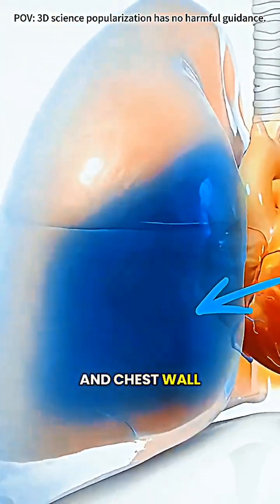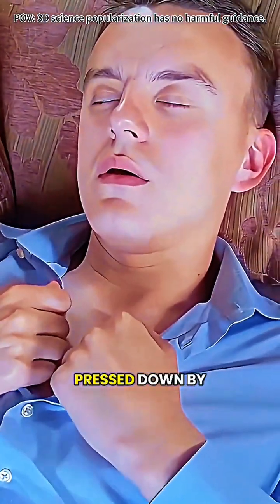When fluid collects between the lungs and chest wall, it can make breathing difficult, almost like your lungs are being pressed down by water.